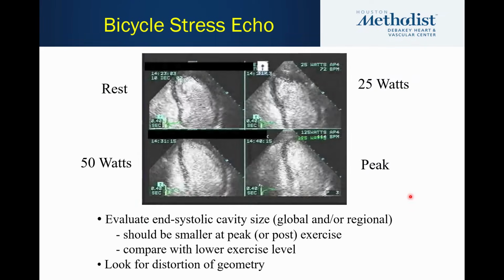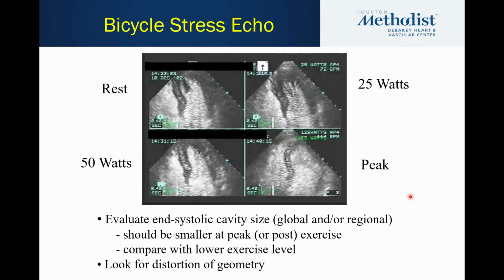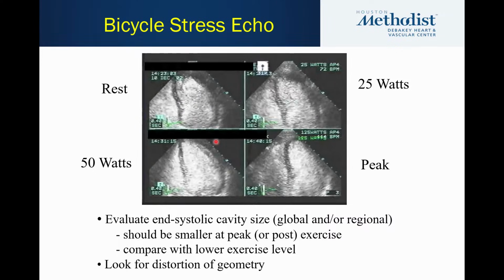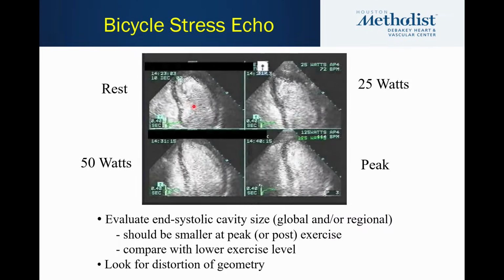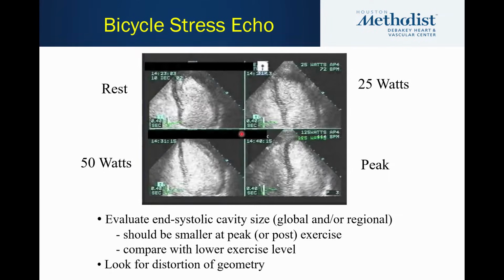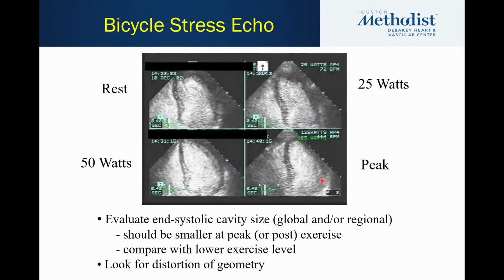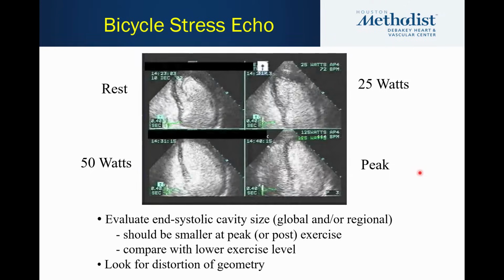So I'm going to let you see that one. Again, use all the tools that I have been repeating multiple times. Look at the end-systolic cavity here at rest, 25, 50 watts, and at peak, okay?